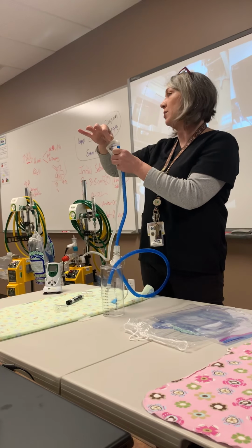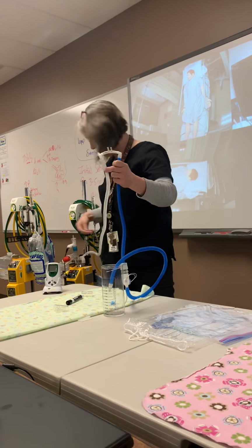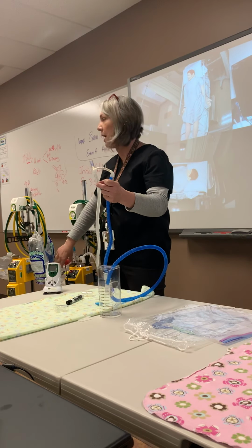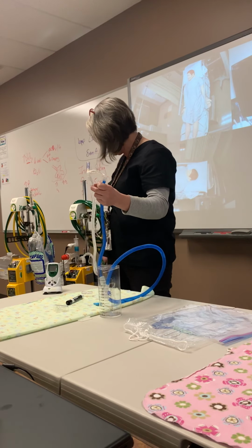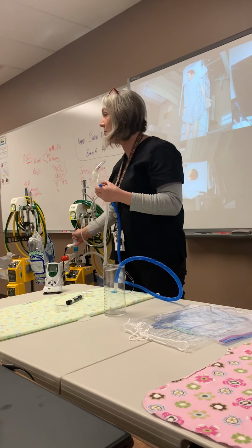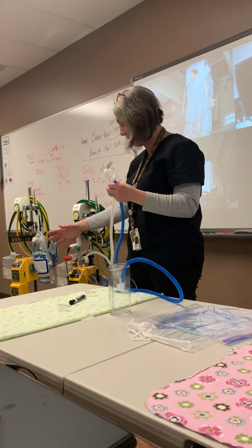Things that will not give you pressure: you've got a leak, a crack, something's not set up right. You don't have your pop off set 2 to 3 above, okay? You don't have that set right. That will cause you not to get bubbles. Like this one has a huge leak right now. I don't have my O2 tubing connected to the top of my nipple adapter, right? So I'm getting no flow. I've got a system going nowhere.